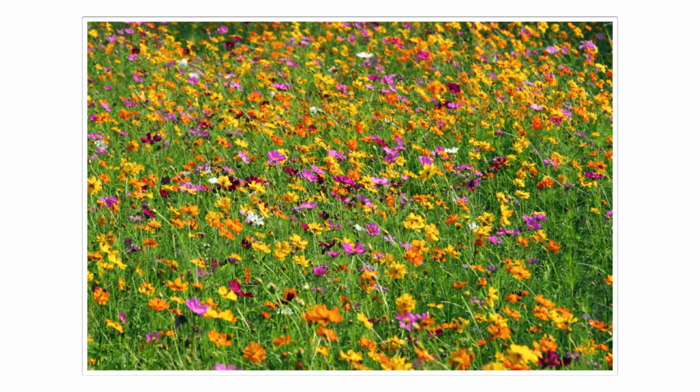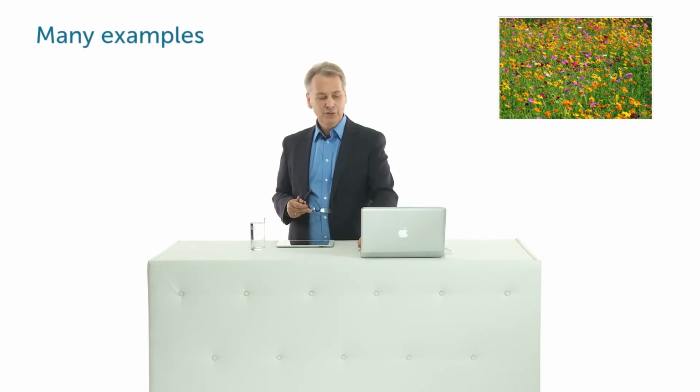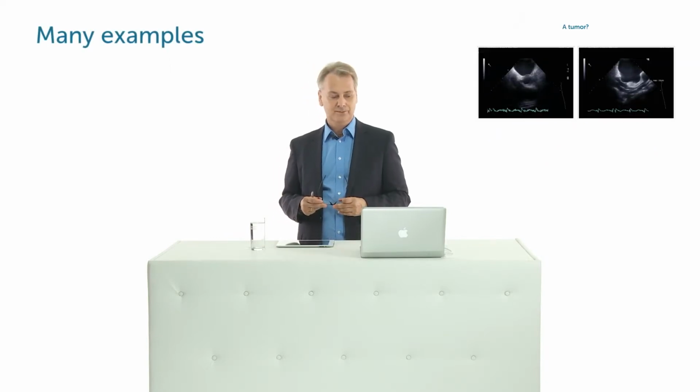How do you get really good at performing a TEE? I think there are two things you have to know. The first, do a lot of studies. You need a lot of practical experience. And the second, you have to see many pathologies. And believe me, there are many, many pathologies to see. And in this chapter, I'm going to show you some of them to help you increase your caseload.